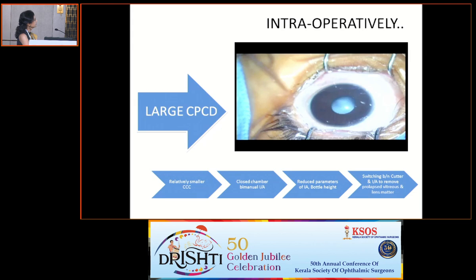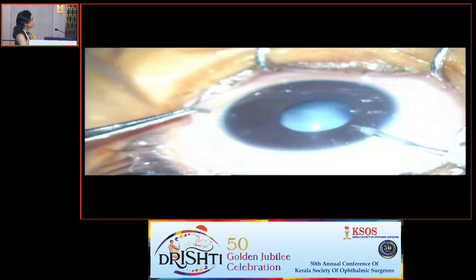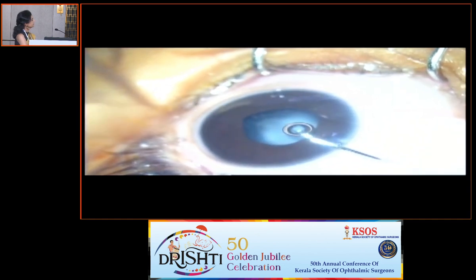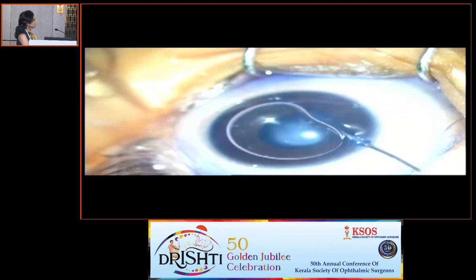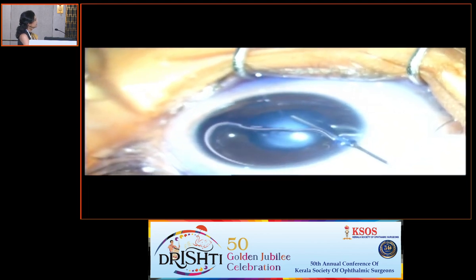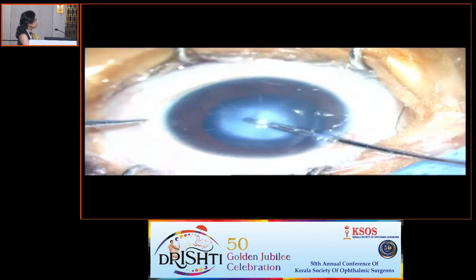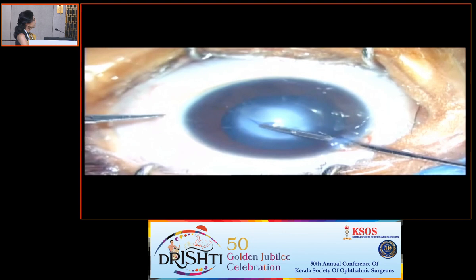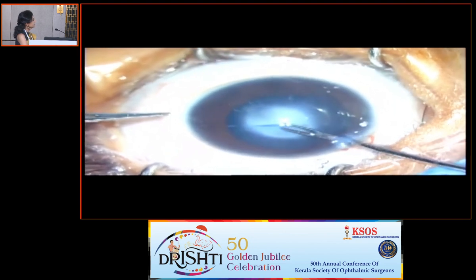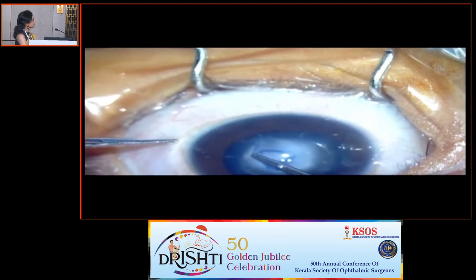So suspecting a congenital posterior capsular deficiency, we proceeded with an examination under anesthesia and cataract surgery. Here you can see the cataract was almost near total, and after staining the anterior lens capsule, we are proceeding with the capsulorhexis, again trying to make a relatively smaller rhexis as compared to the usual standards, because we are expecting a posterior capsular defect in this case.